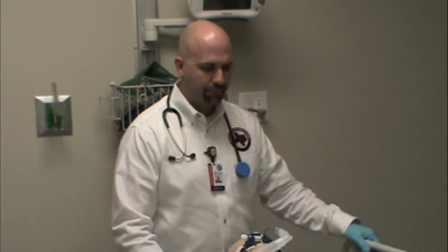Also, the sending physician or the nursing staff that may be at the bedside are also a good resource to use if you want to make sure everything looks right before you walk out the door. And sometimes it's a good safety step before you leave to have the physician take a look at your monitor and see what the vital sign parameters are before you walk out. That way everyone feels good about what you're walking out of the ER with.